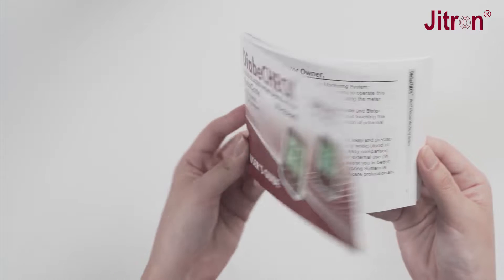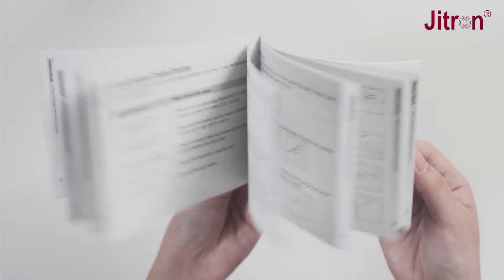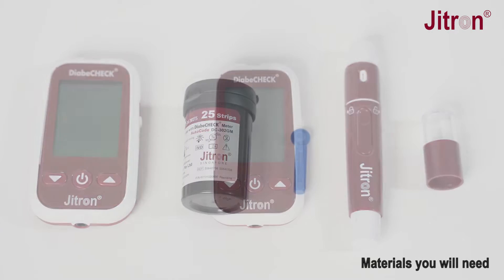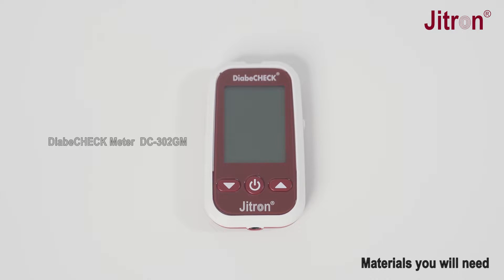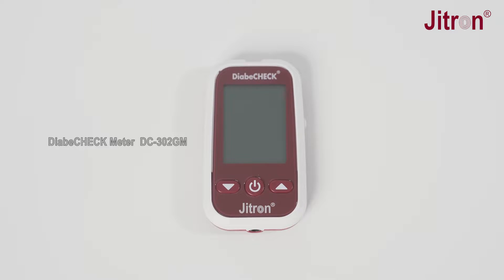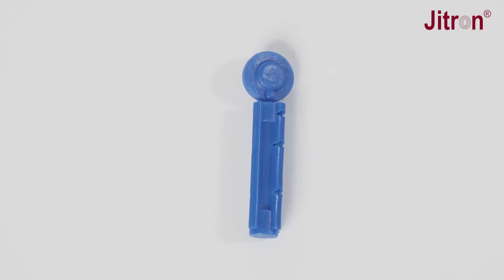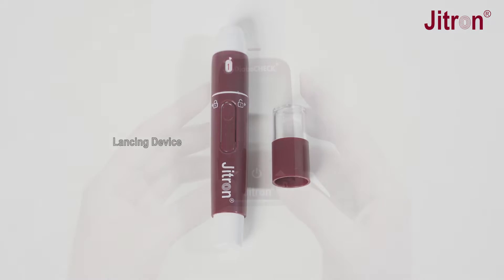Please read the user's guide carefully before using the meter. You should have the following items to test: the Diabicheck Meter DC302GM, a new Diabicheck Blood Glucose Test Strip DC302TS, a sterile unused lancet, and a lancing device.